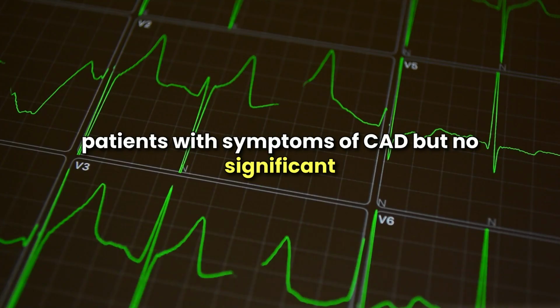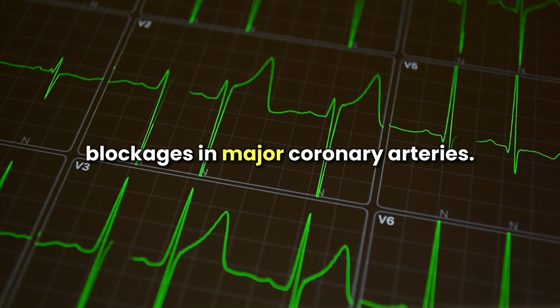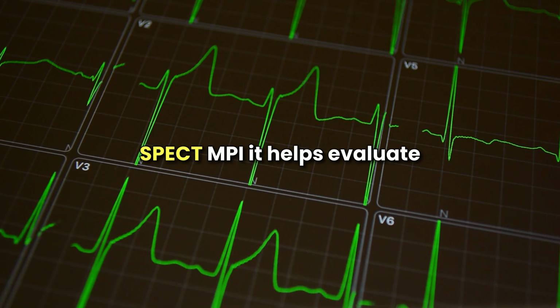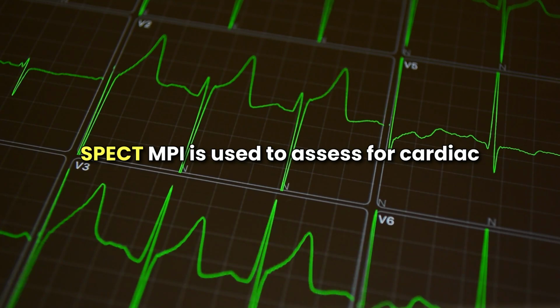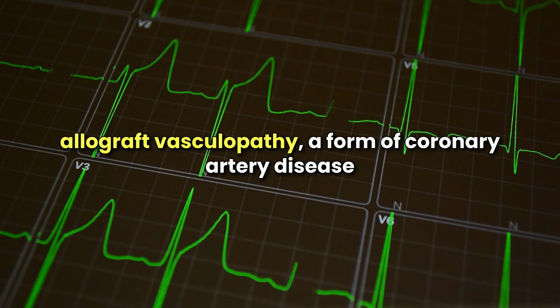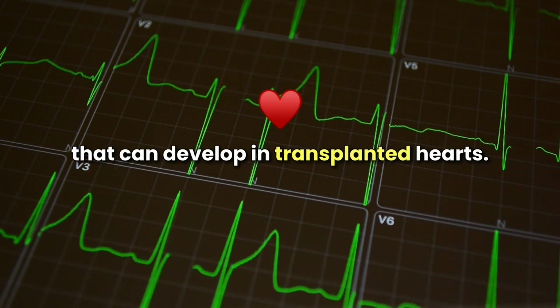For patients with symptoms of CAD, but no significant blockages in major coronary arteries, SPECT MPI helps evaluate coronary microvascular dysfunction and guides management. In heart transplant patients, SPECT MPI is used to assess for cardiac allograft vasculopathy, a form of coronary artery disease that can develop in transplanted hearts.